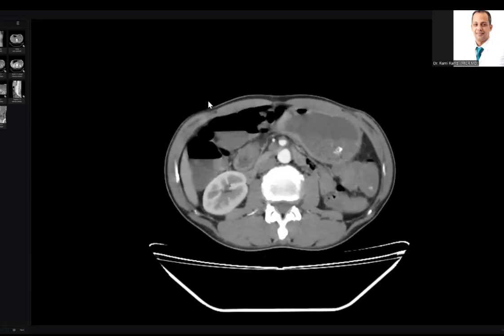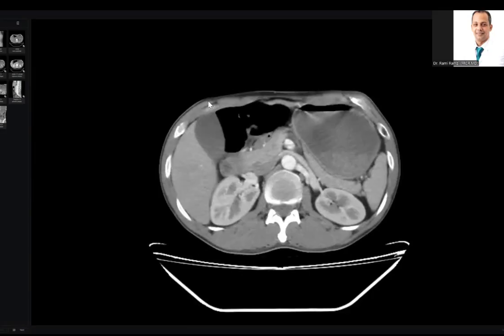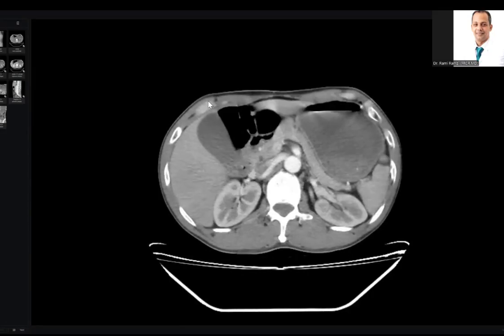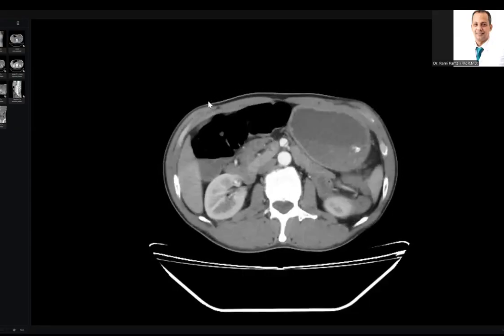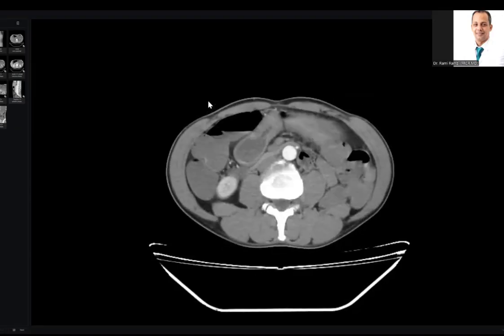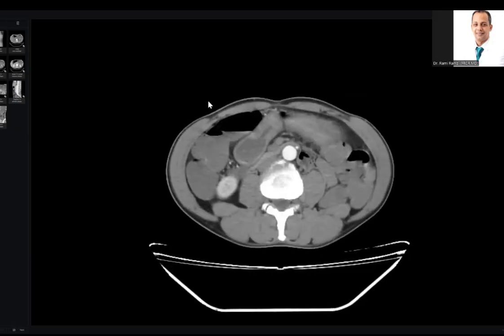Here in the center of the abdomen at the transverse colon, I can see a dilated bowel loop noted here. I'm trying to check where this is from. Okay, and there is a focal area. Sorry, doctor, can you go up?